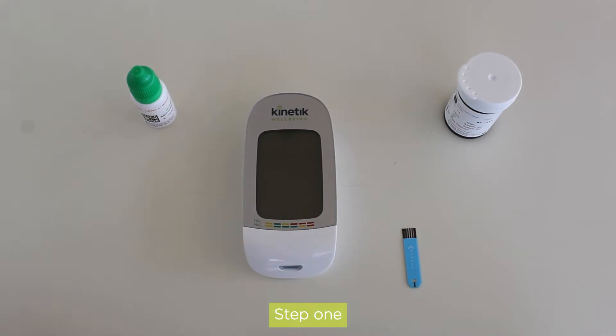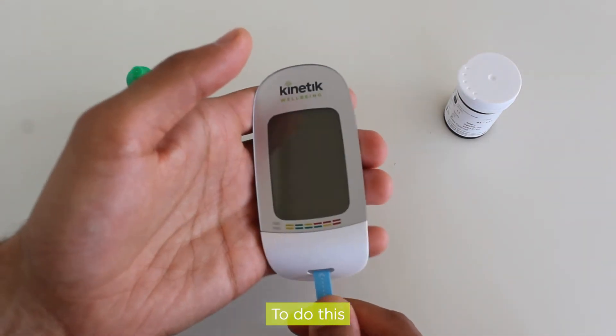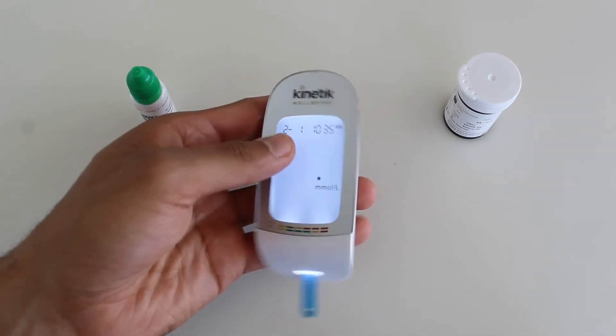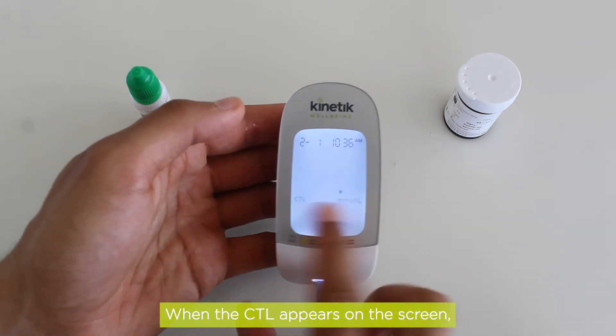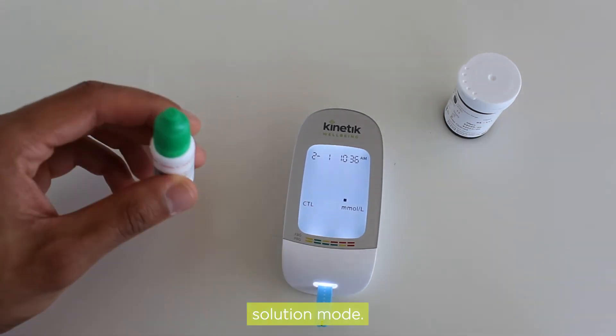Step 1: Turn on the control solution test mode. To do this, first insert the test strip into the meter when the meter is off. When the blood symbol appears, press and hold the S button. When CTL appears on the screen, the meter is in control solution mode.